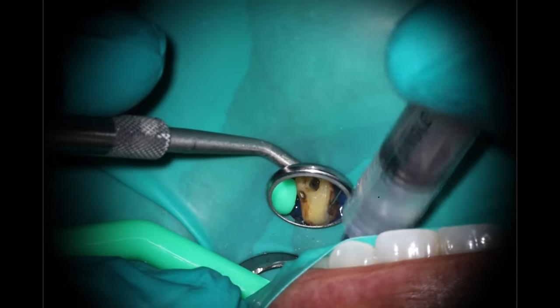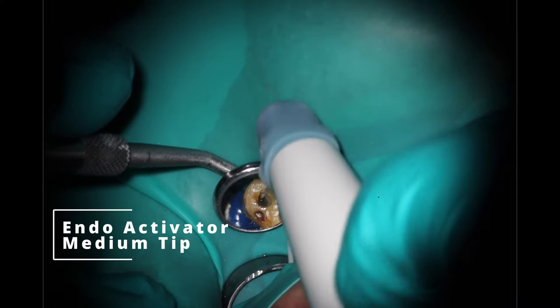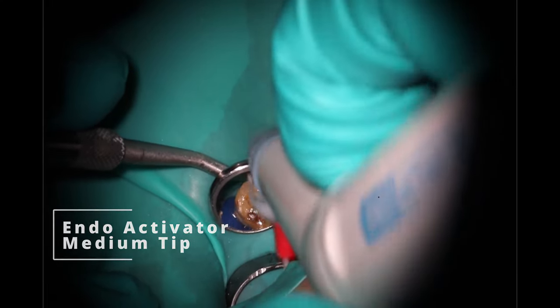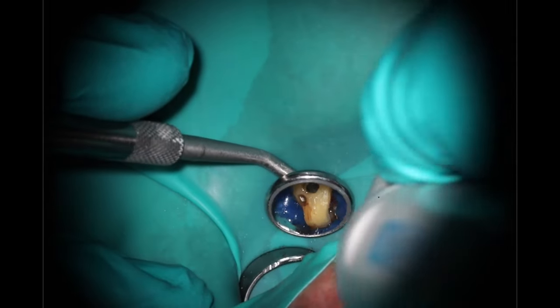You do have to be careful with EDTA — overuse of it can soften the root surface as well, which can lead to ledging or perforations, which is never a good day for anybody. And then once you've got close to the length here, go back in with your rotary files and very gently peck down to that length and feel for that stick. At this point, we have actually got to length — everything looks great. So we're going to do our final rinse here, rinsed out with the Triton, going back in with the endo activator.